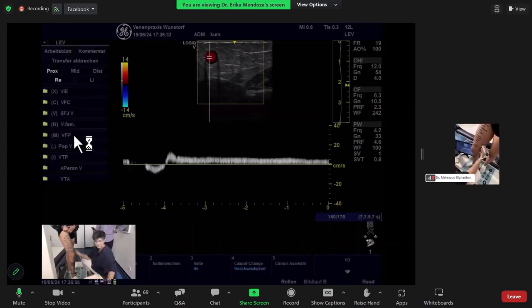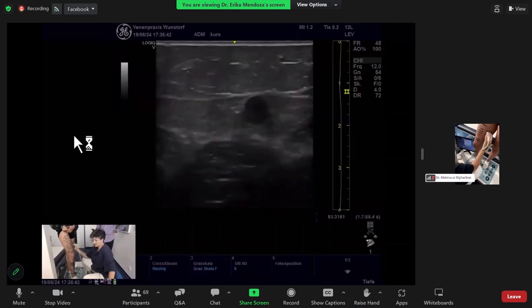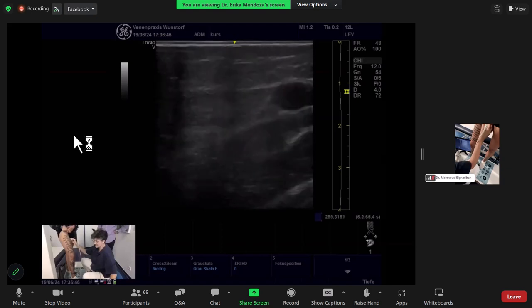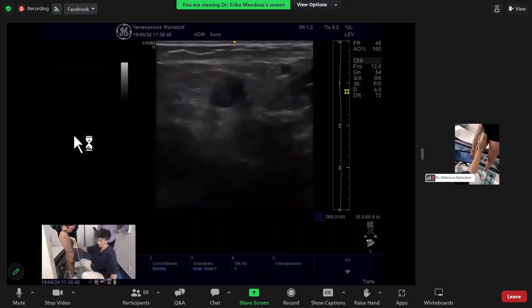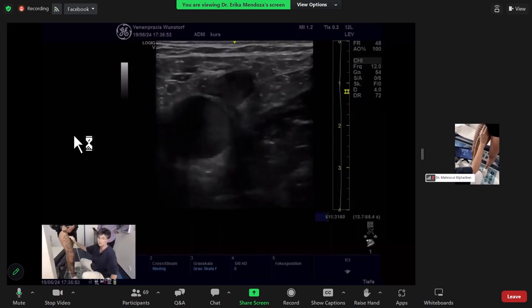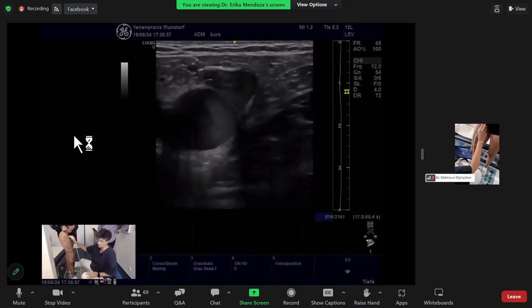Would you consider what is normal is less than half a second of reflux? I think normal is less than 0.5, but this doesn't mean that reflux means more than 0.5. For me, reflux is more than 1 second. Okay. Because more than 0.5 second is very, very short.